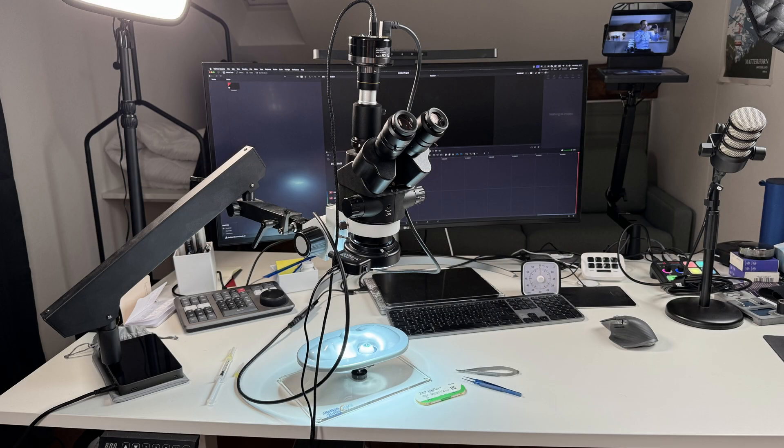YouTube has flagged my last two surgical videos as violent content, so today I'm using a plastic eye and my microscope at home to show you this technique.